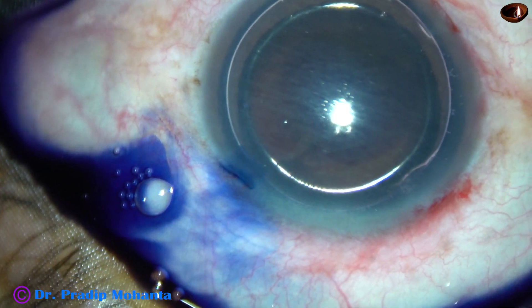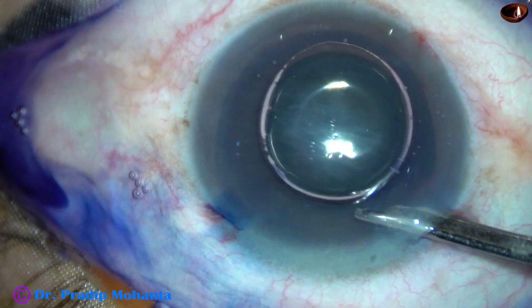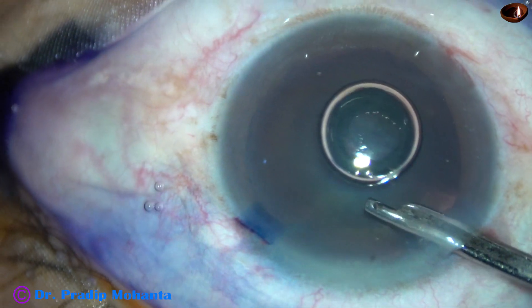And now the anterior capsule has been stained with trypan blue dye underneath an air bubble, and the dye is washed out with BSS.